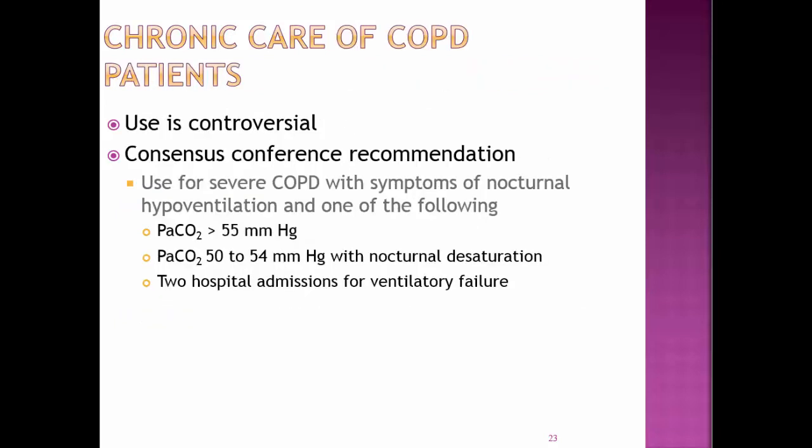For your COPD patients, your use is controversial, but they have come to a consensus and they do recommend non-invasive use for severe COPD with symptoms of nocturnal hypoventilation, and one of the following: the CO2 of 55, the CO2 of 50 to 54 with nocturnal desaturation, or they've had 2 hospital admissions for ventilatory failure.